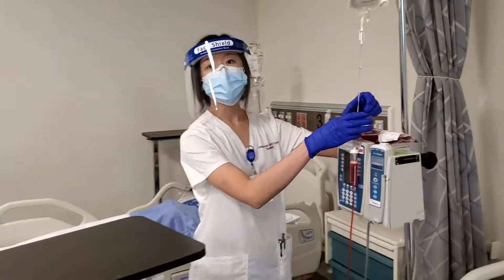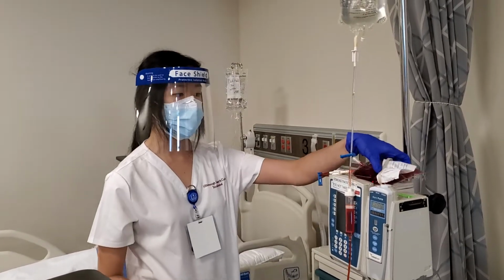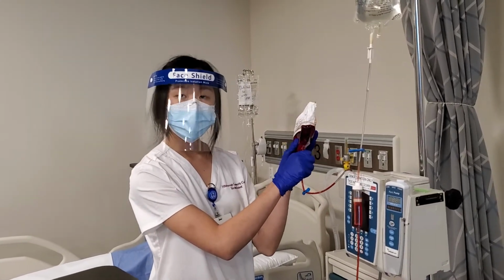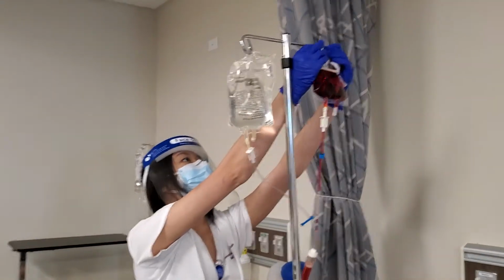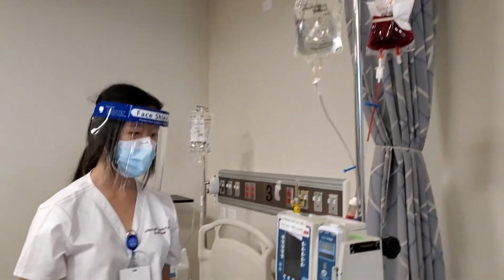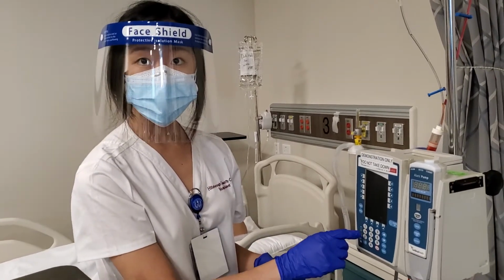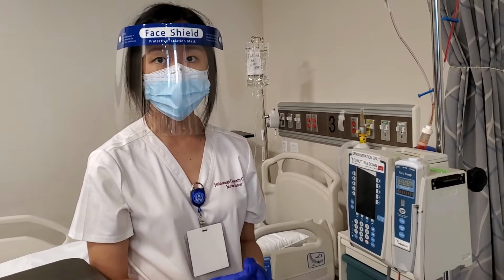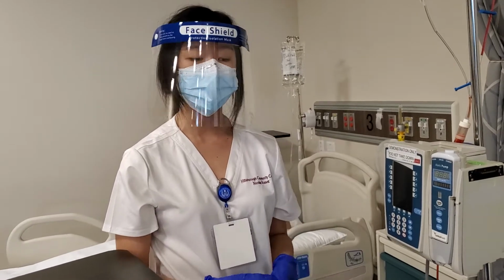And then we can clamp the saline tubing, make sure that it's clamped, and then now we are going to get our blood bag and spike the blood bag and hang it up. And then we unclamp it, and then we are going to set the infusion rate for a slow rate, for example, like 5 milliliters per minute or whatever is ordered for the first 15 minutes to monitor the patient's reaction.